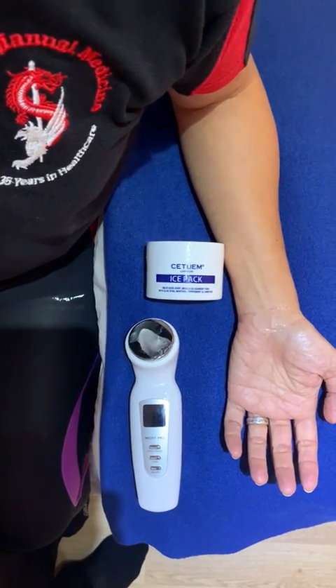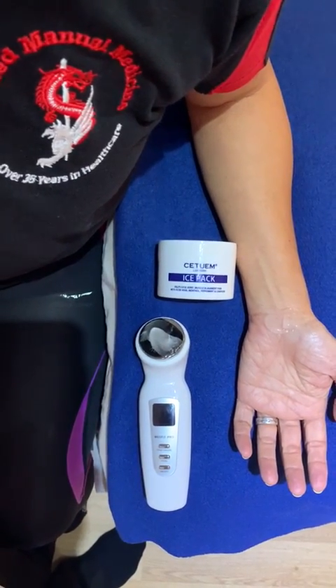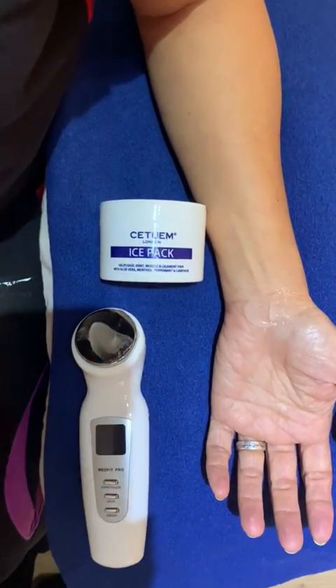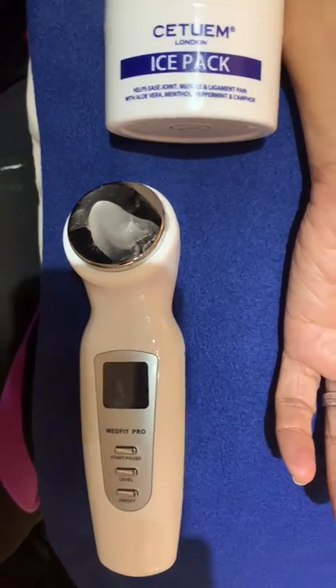When treating patients with wrist problems, particularly carpal tunnel syndrome, we utilize the Cetuem ice pack gel in relationship to an ultrasound machine.